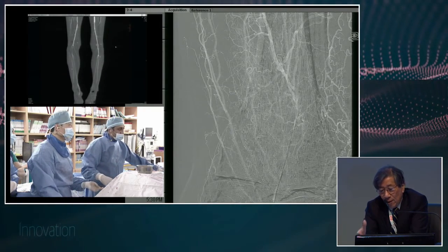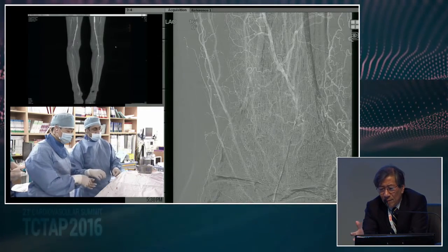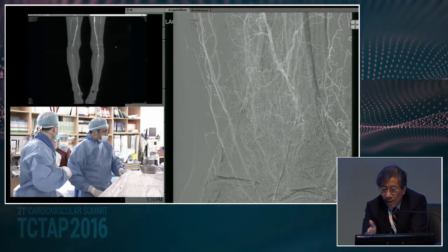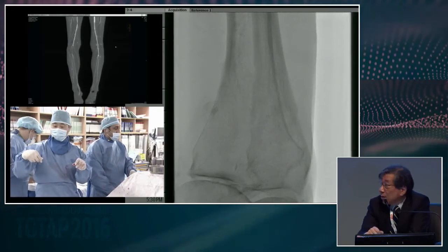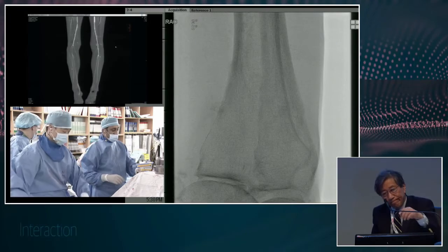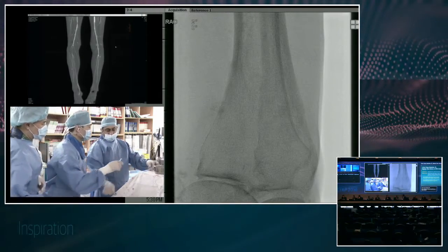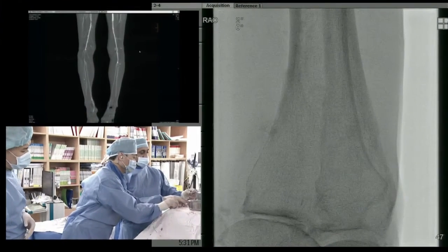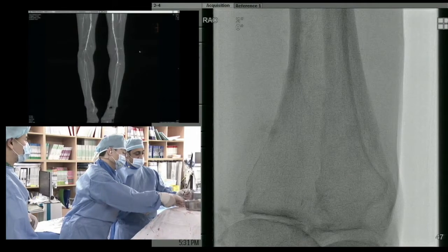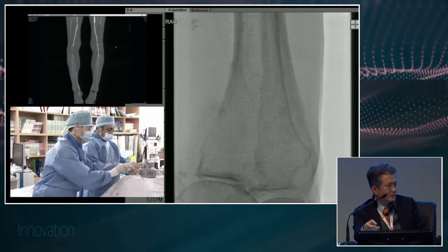But injecting from the proximal big catheter looks like a mess, and I cannot identify the vessel well. So selective injection is much better to understand distally what's going on right now. Yeah, I agree. Absolutely, I completely agree with you. The angio showed no clear connection between the proximal and distal, so maybe we cannot see the connection clearly. So selective injection may help, and/or distal puncture.